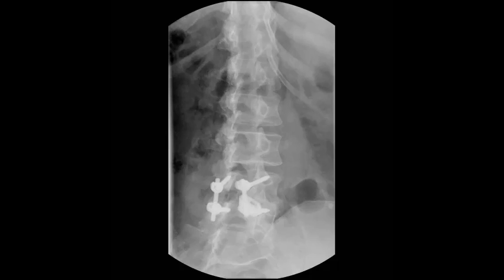Next, I identify the interlaminar spaces, which I will outline for you. L1, L2 is outlined in gray, L2, L3 is outlined in yellow, and L3, L4 in black. As you can see, the L2, L3 interlaminar space projects on top of or over the L3 vertebral body.